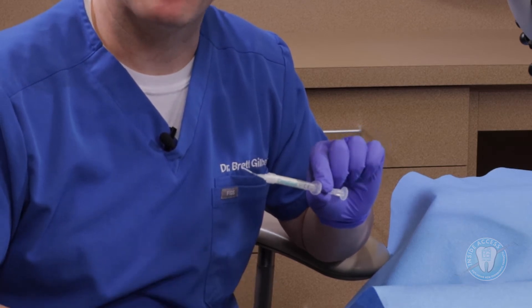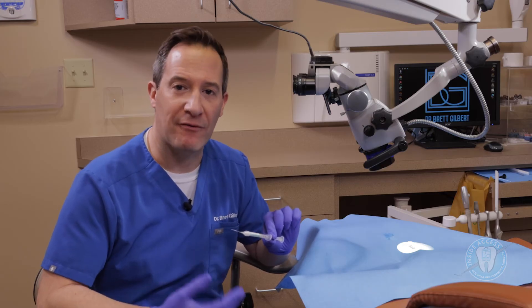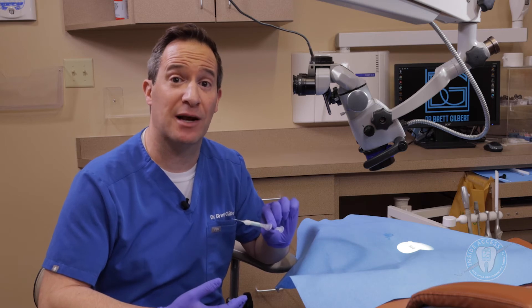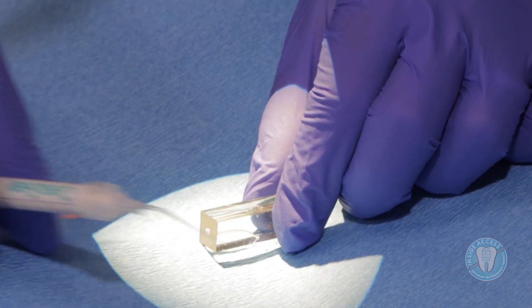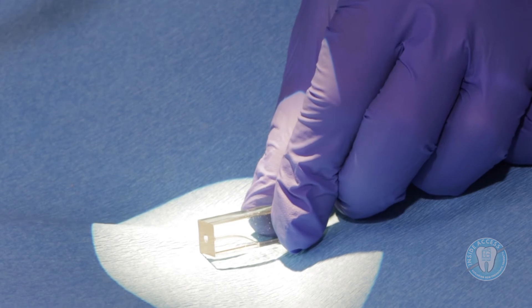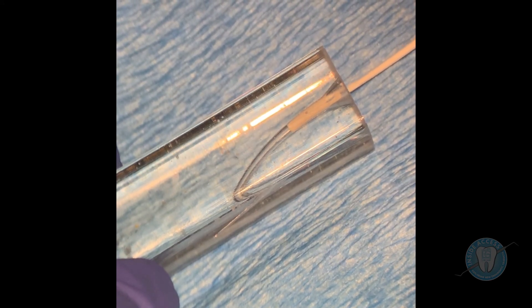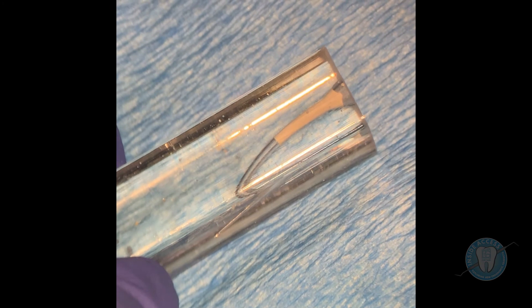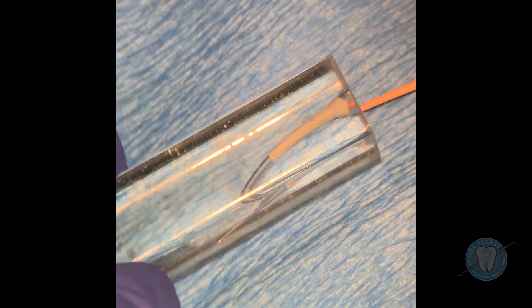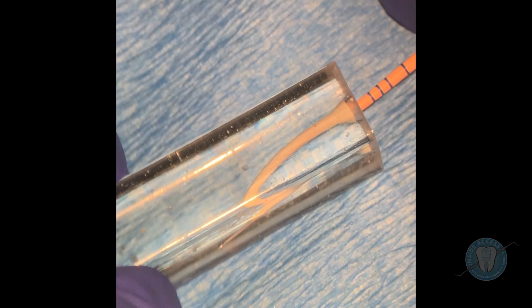The Meta Ceraseal Bioceramic Root Canal Sealer is another product I've been using in my practice. I'm going to show you how I use it. In a situation like this, we're going to do a hydraulic condensation technique, which involves placing the sealer right in the coronal third of the canal. I'm going to take the tip just down into the orifice to about the top of the coronal third, inject a little bit of the material, then back out. The idea of hydraulic condensation is that when you bring the gutta percha in, the gutta percha carries it right down and pushes it against the walls of the root canal.